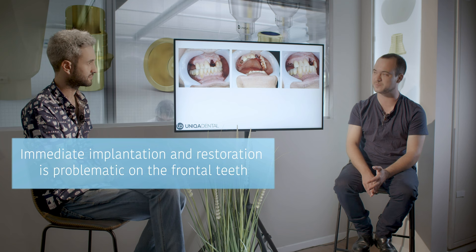Of course, you can have immediate implantation and even immediate loading. But if you have immediate loading on a frontal tooth, you'll have forces on this tooth. Immediate implantation with immediate restoration is a problem in frontal teeth because they have a lot of vertical forces, which can interfere with osteointegration. We can't be sure the end result will be fine or that we'll achieve osteointegration. So in many cases, we try to avoid immediate loading.